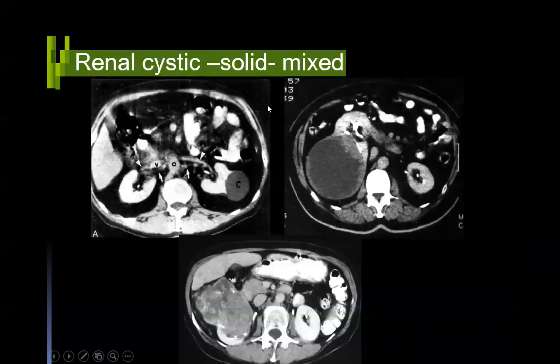Okay, again, let's see a few examples. Now there's a cyst in the left kidney. You can see this is a post-contrast study. You can see enhancement in the rest of the kidney. There's also contrast in the aorta and the IVC. So this cyst does not enhance. Again, if the cyst doesn't enhance, it is a simple cyst, which is category 1. Okay, so leave alone.